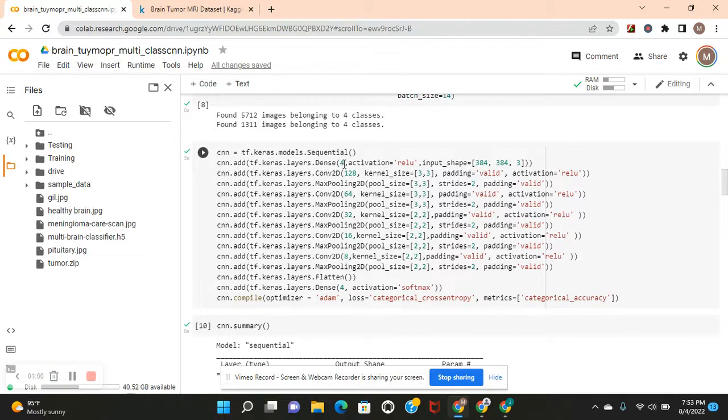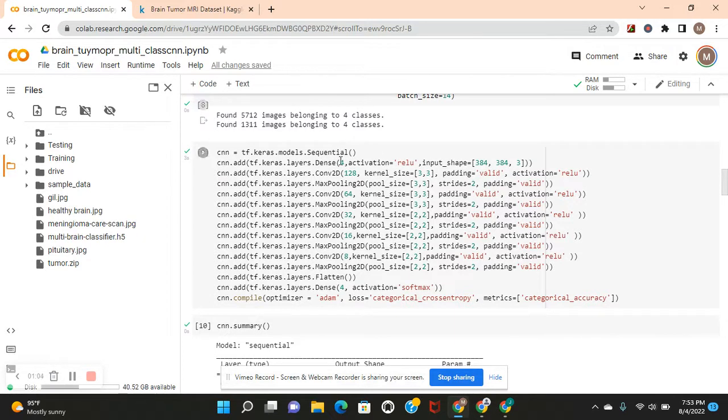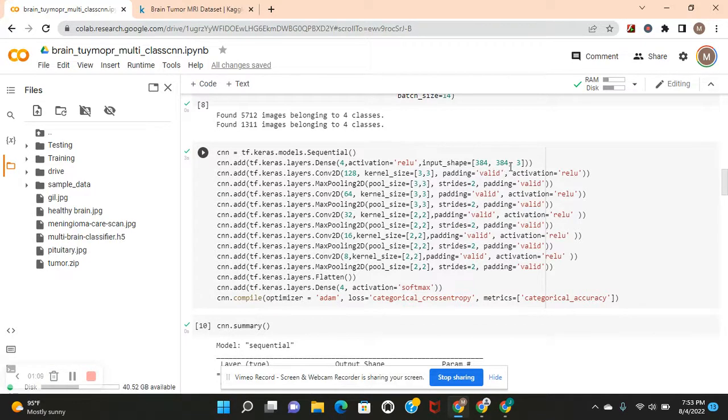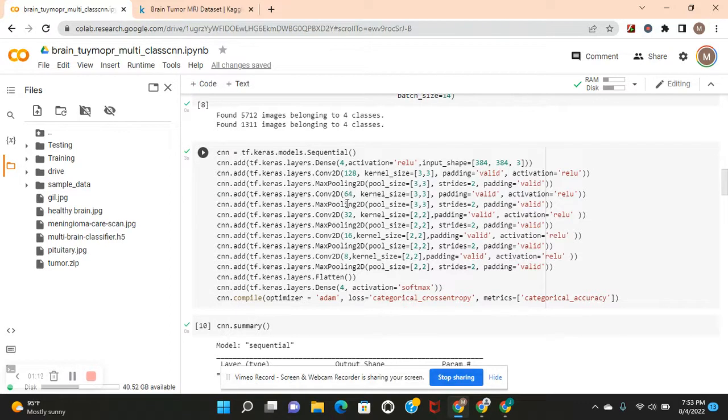Dense 4, activation equals ReLU. You do dense 4 because there's four classes. 384 by 384 from the target shape, and then three. 128 all the way down to eight. Pass these kernel size and pool size parameters.